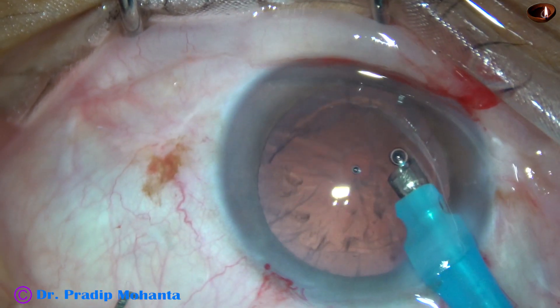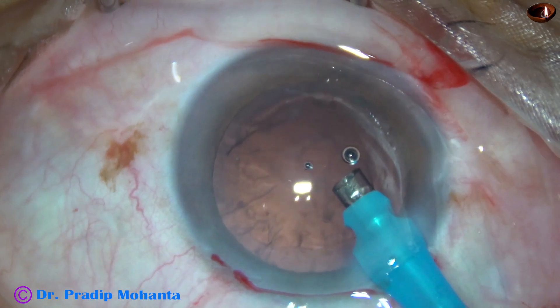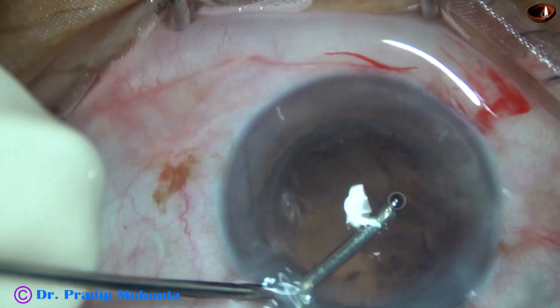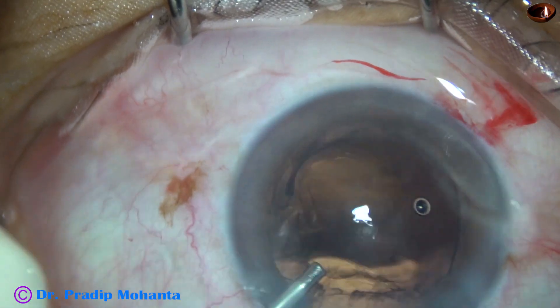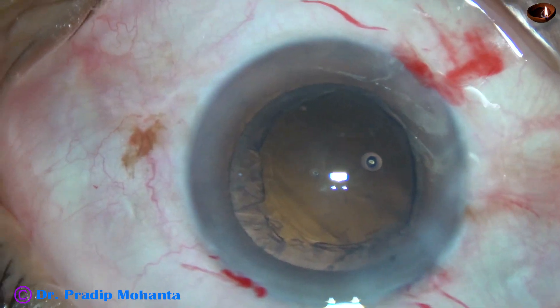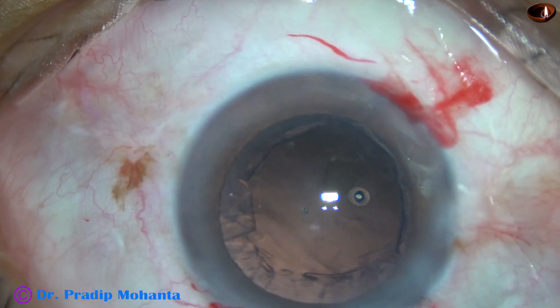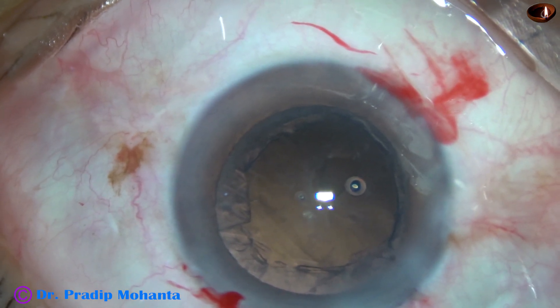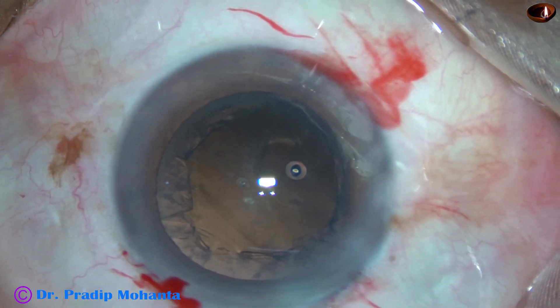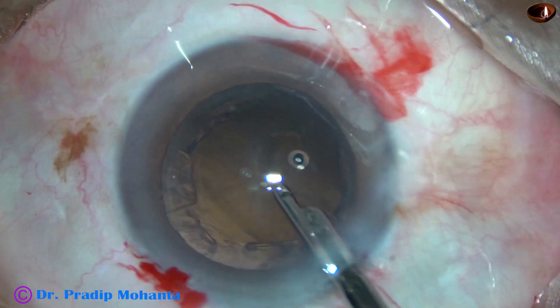Emulsification of the nuclear fragments is complete, and there is a small rent right in front of the tip of the phaco needle. So, without coming out, I asked my assistant to inject Viscoelastic — this is HPMC. My take in this case is: during emulsification of the last piece, the hard material was above and soft epinucleus was below. The tip of the phaco needle was between the soft epinucleus and hard nuclear material, which was above, and it caught the posterior capsule. The anterior chamber stability was not as good as on other days.